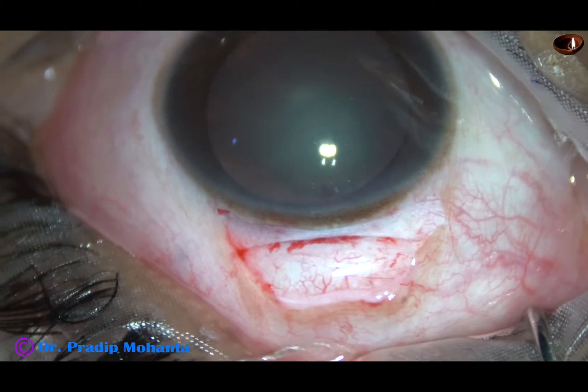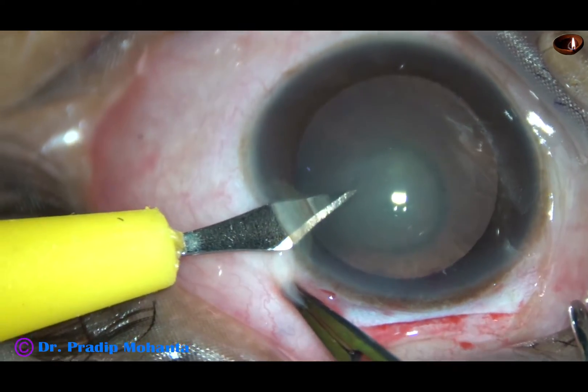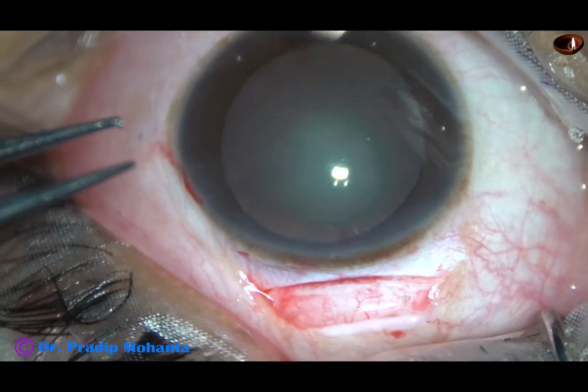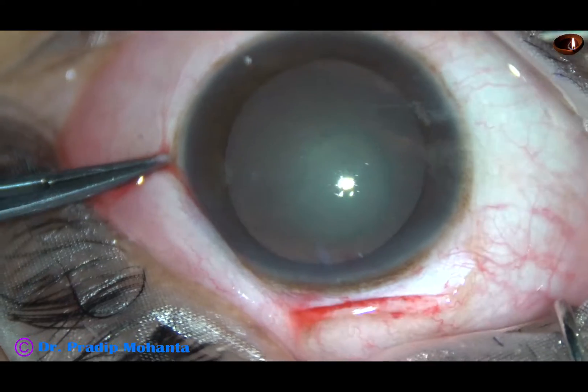Now a side port on the left side of the main incision and another side port is being made on the right side of the main incision.